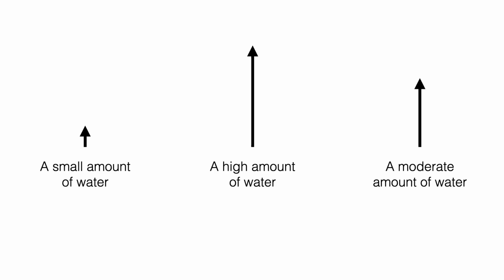Recall that in a particle of water, every hydrogen atom has a magnetic vector associated with it, and if that droplet of water is put in a large magnetic field, those magnetic vectors ever so slightly align with the external magnetic field to create a net magnetic vector. This is that net magnetic vector, and for different amounts of water, we would have different vector sizes. So a small amount of water would give us a small vector, and a large amount of water would give us a large vector. The sizes of these vectors is what MR images.